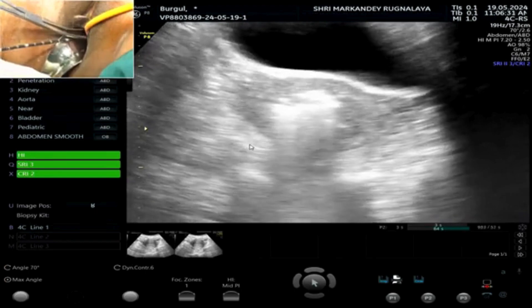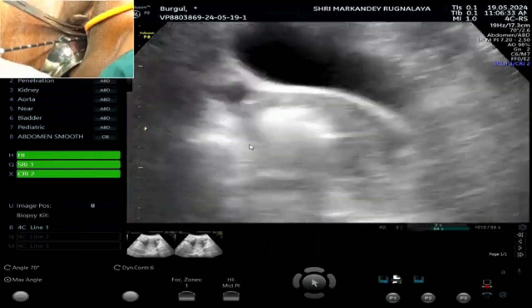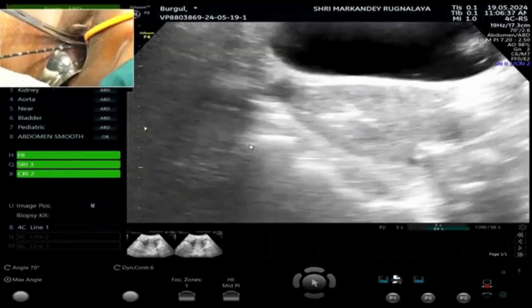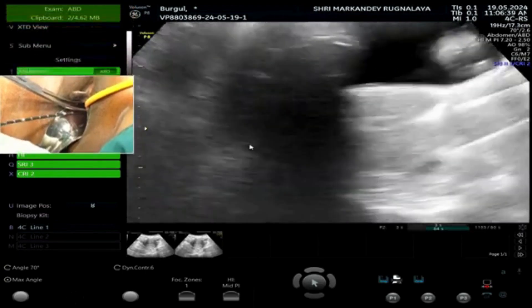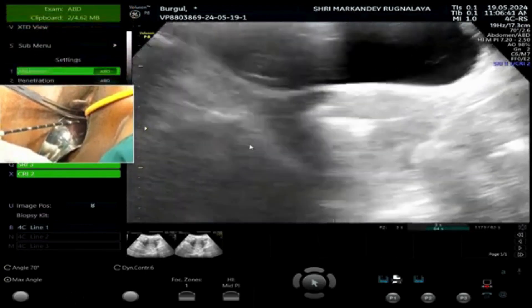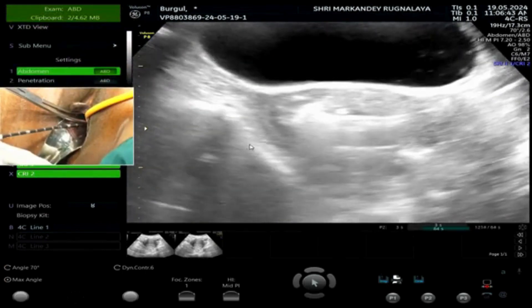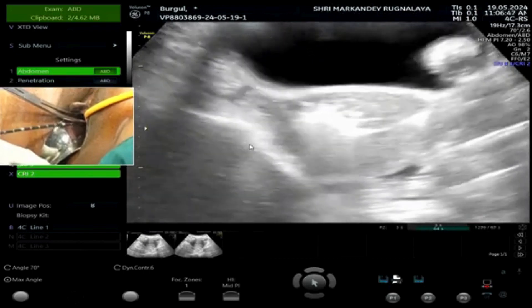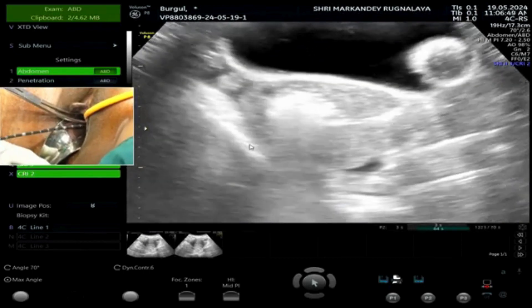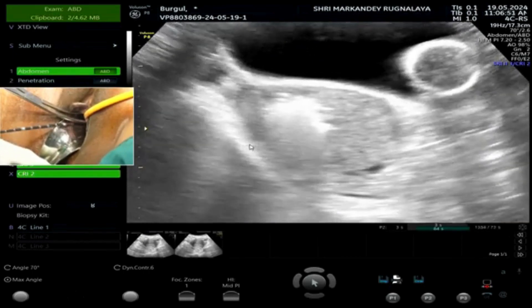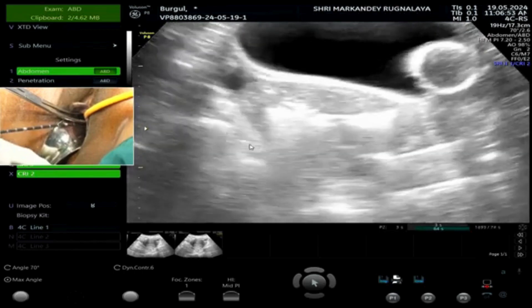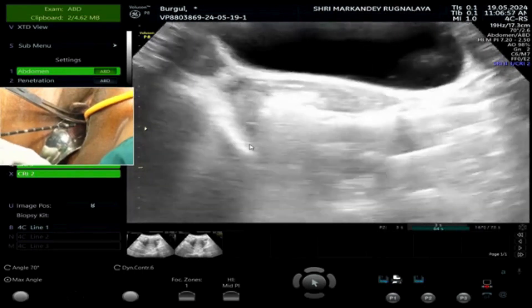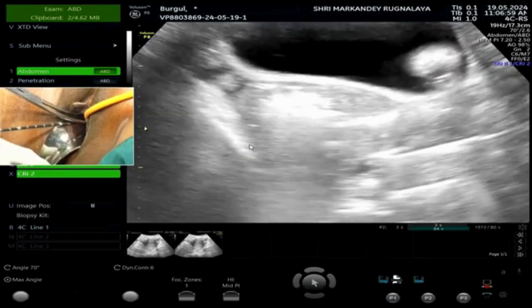Now the arm has crossed right here — I have reached the patient's left ostia side. You can make your own road. The main aim is to destroy all the endometrium. Is there any hint that total ablation is complete? No, we have to check with hysteroscopy and Doppler. You can do Doppler and hysteroscopy after.